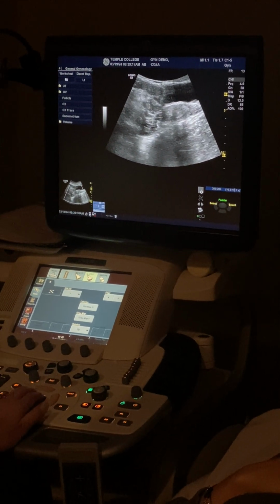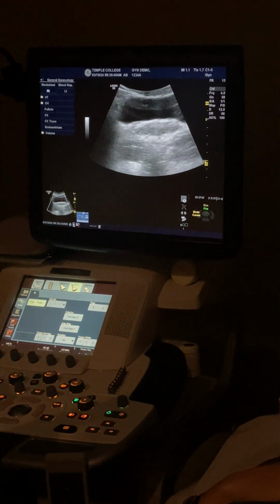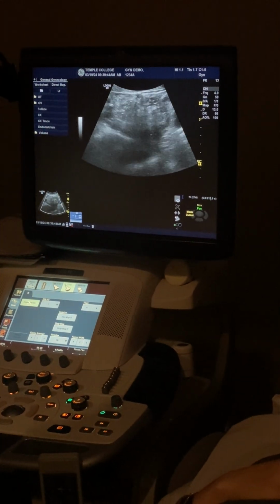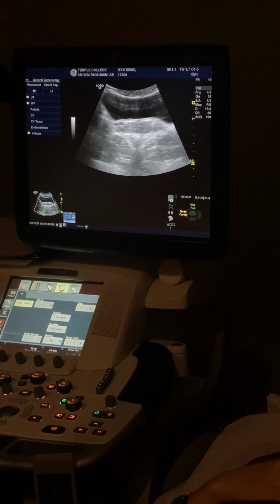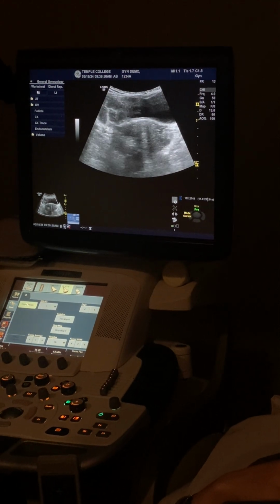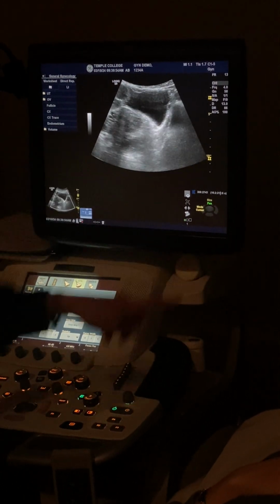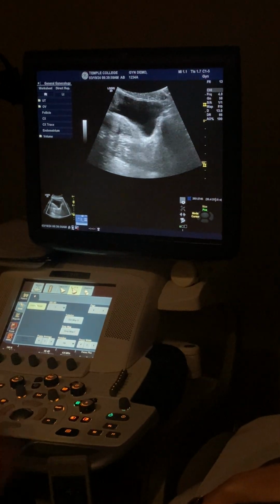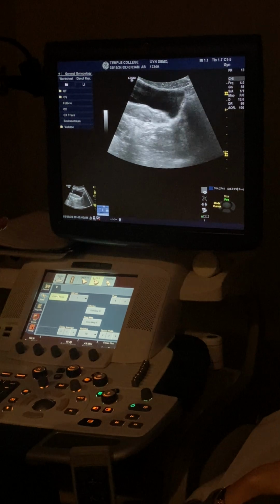So this right here is going to be the ovary. See those little follicles on it? Use that to find it. Don't just start here and go, I don't see it, because you'll never find it. Unless it's just PCOS and they're just right there. So use that technique. Come up. This ovary is sitting here. I'm just going to angle. I didn't move. I didn't slide. I literally just angled because I'm using that bladder. I want that bladder to help me see that ovary better. Okay?